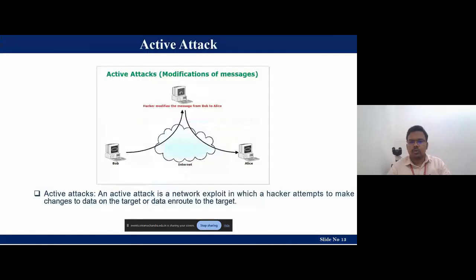So in order to secure our medical device system, definitely we need to understand this. So who is the attacker and what are the types of attack, and we have different types of medical devices in our healthcare system. Each and every system is vulnerable to a particular type of attack.